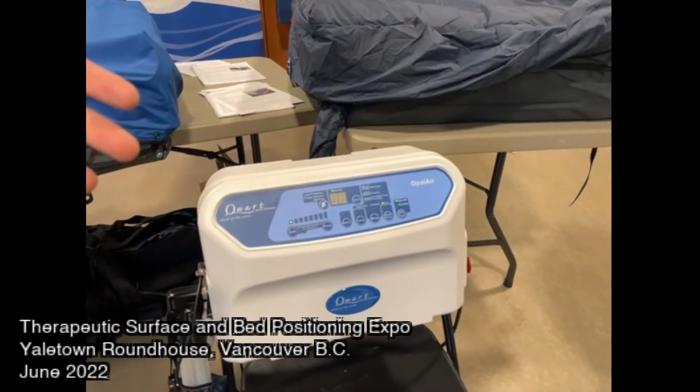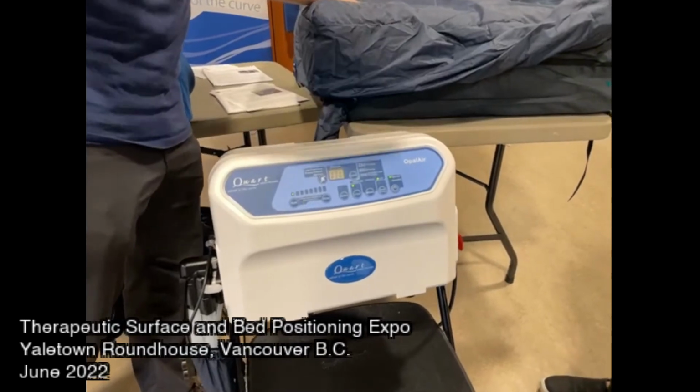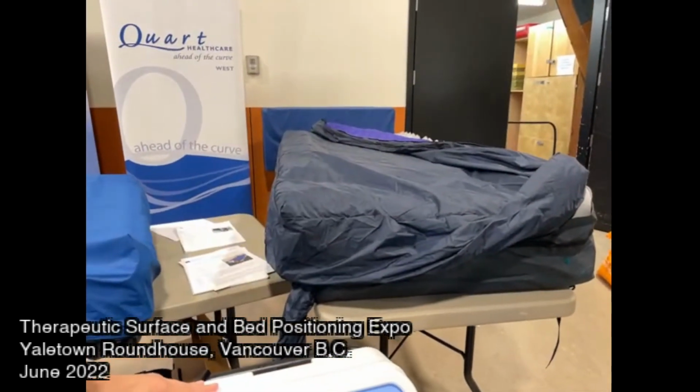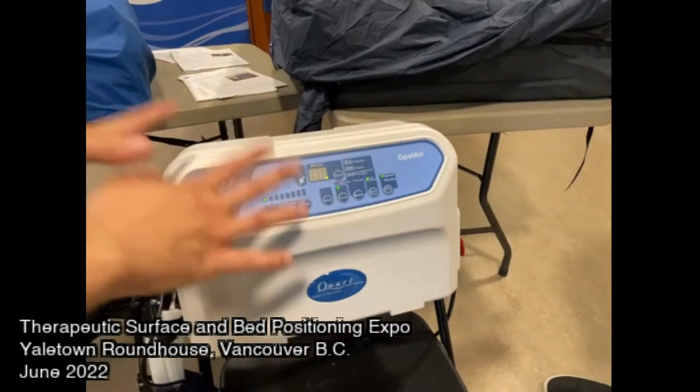It locks itself so it doesn't get tampered with. So it'll bring you to what it thinks is the optimal pressure for the client. But you can customize it, the client might want it a little more firm, or a little less firm. And then you just use soft and firm to make changes once it's finished. So that's like auto detect.